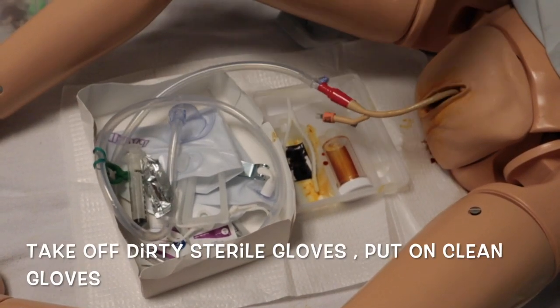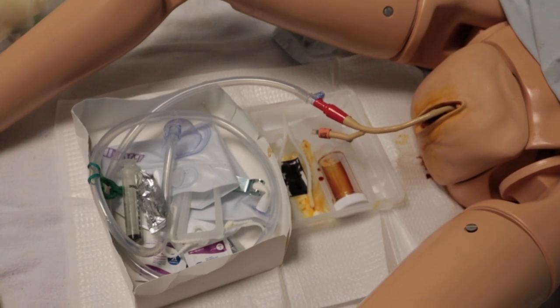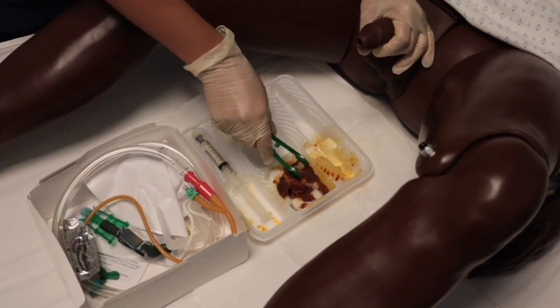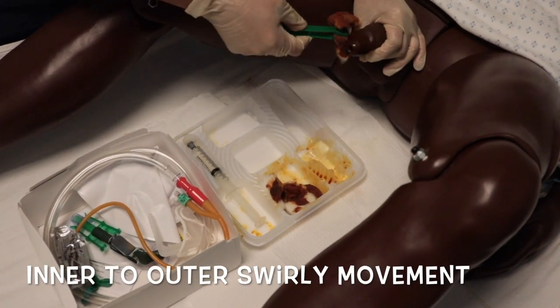Take off the dirty sterile gloves and put on clean gloves. The steps are the same with male patients. With the hand closest to the patient, hold on to the shaft of the penis and clean the urethral opening with an inner to outer circular movement.